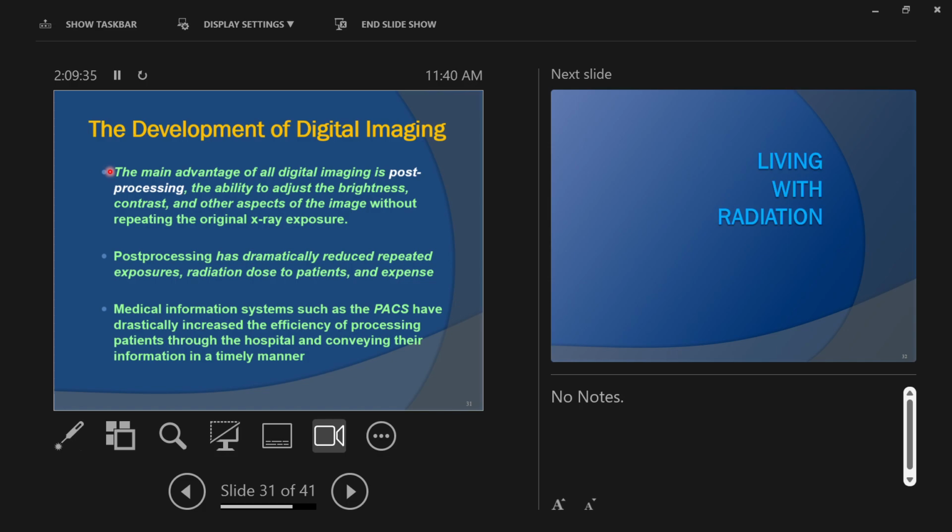With digital, we're not, right? If you've played with these at all, we have a lot that we could do with our digital images. I just learned at my office, you guys probably all know about the inversion, right? Black to white, that's one, but we can also make the images pink and blue and red and green and all these other hues, because sometimes these other hues are better to see things. There's a ton of functions you can do, like taking all the black pixels and turning them red. It's all called post-processing.